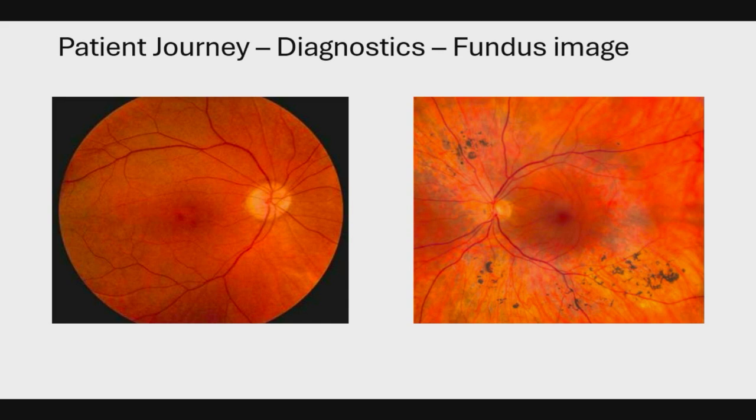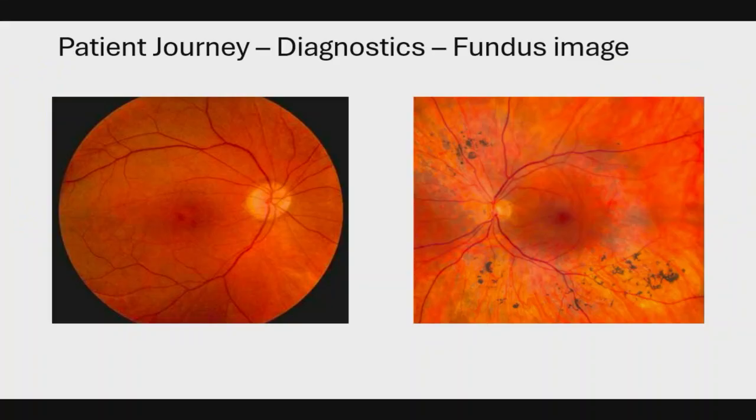Here, unfortunately, you can't see it very well, but you can already see a slightly darker area, which is mainly dark because the surrounding central retina is a little bit light. So this is the so-called bull's eye. You don't always have it, but sometimes you can see it from this pattern of this bull's eye, where people play the game of shooting arrows on this target.